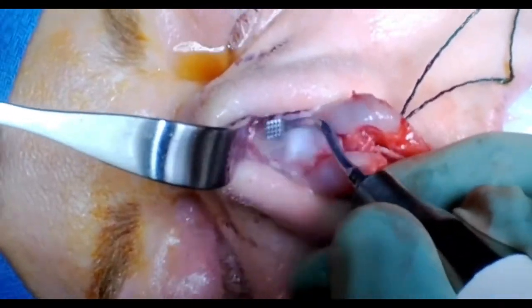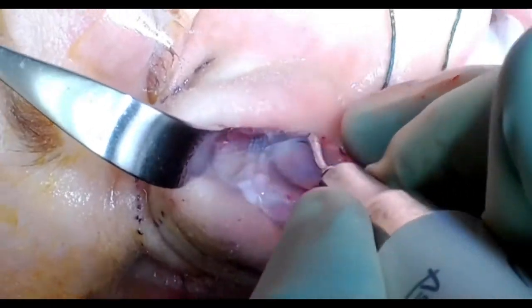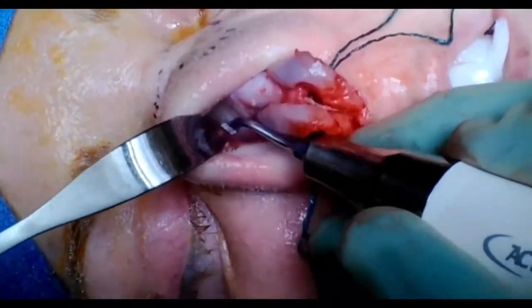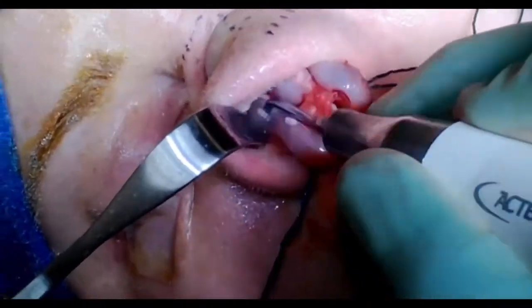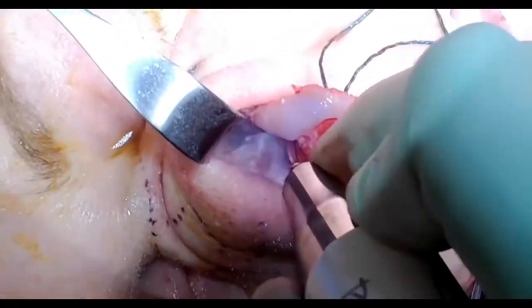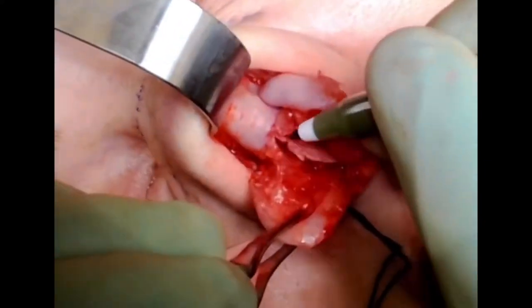What we're doing now is taking down the bony cap. The bony hump is really mostly cartilage, but the cartilage grows in a way that pushes up the nasal bones, and there's a thin bony cap overlying the cartilaginous bump. The piezo device is a nice way to uncap and reduce the bony portion of the convexity and expose the underlying cartilaginous convexity. I'm working at the lateral keystone area, just shaping these bones, narrowing the nasal bones just a bit, as well as weakening the bony-cartilaginous junction, which is going to help us flex the dorsum down.